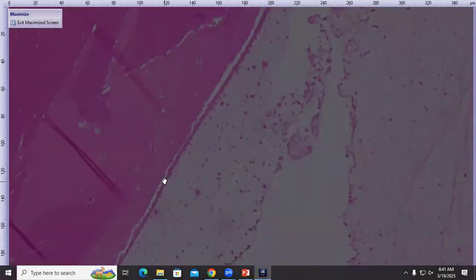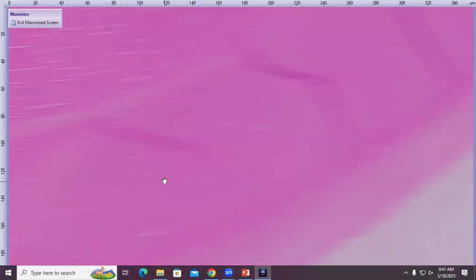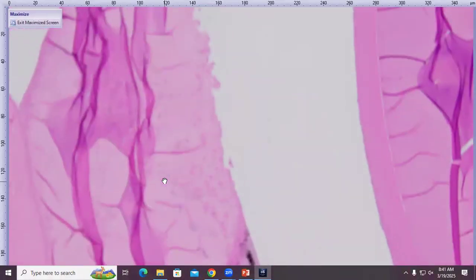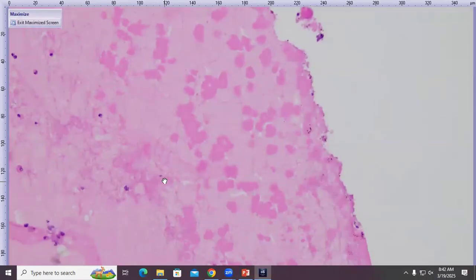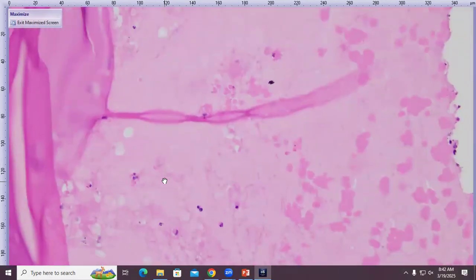And we are also seeing that lens material up here in the anterior chamber as well. So again, this also might have been contributing to what they were seeing clinically with the amorphous white blobs in the anterior chamber, coupled with this proteinaceous material here.